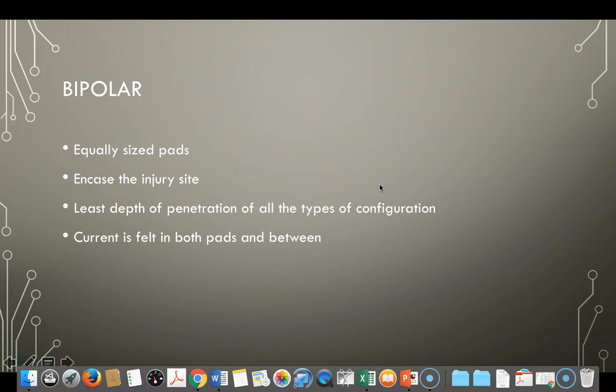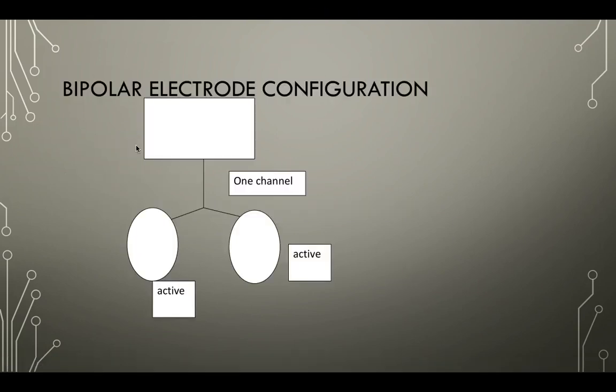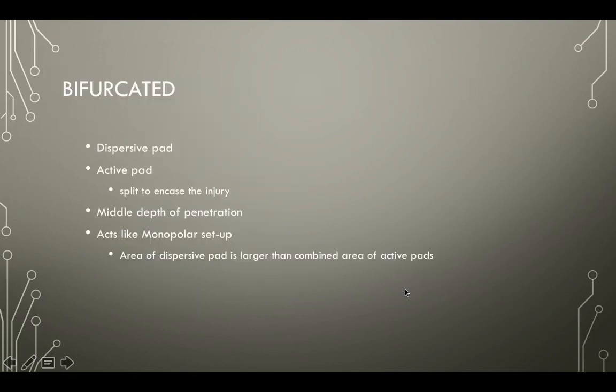Are your pads close together? That's going to be more superficial. Are they further apart? That's going to be more deep. And the current should be felt in between the two pads. So felt in both pads equally as well as in between. And again, because that target tissue is going to be in the middle. So our experience for this is, again, we have that one channel, and now we have two equally sized pads that are both active. So we would put the target tissue in the middle, but they have equally sized pads for the bipolar electrode configuration.